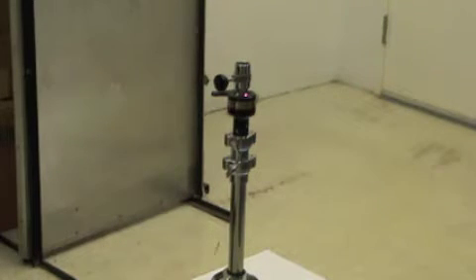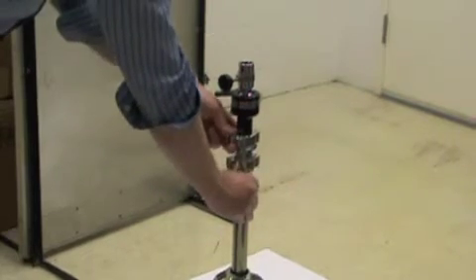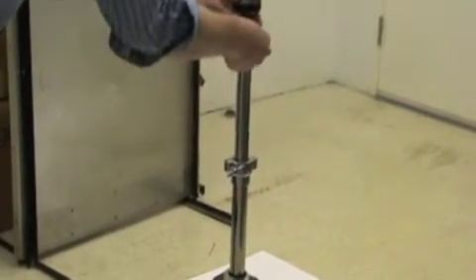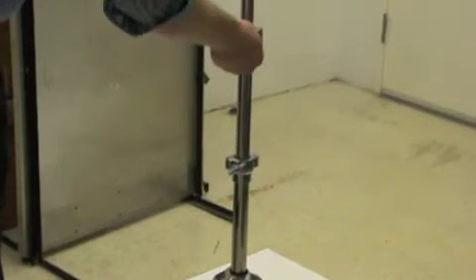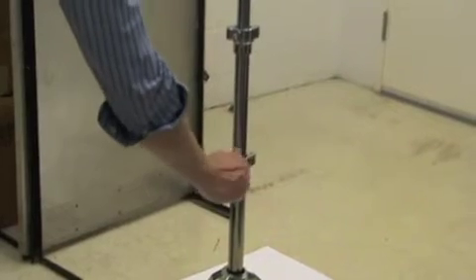Adjust stand height by loosening the wing nuts on the telescoping stand and raising the bars. Tighten all wing nuts prior to mounting the head.